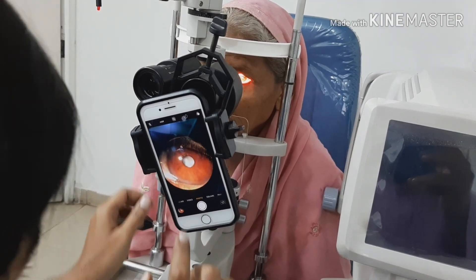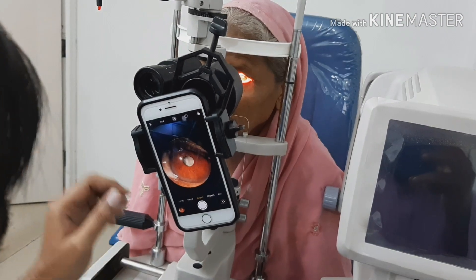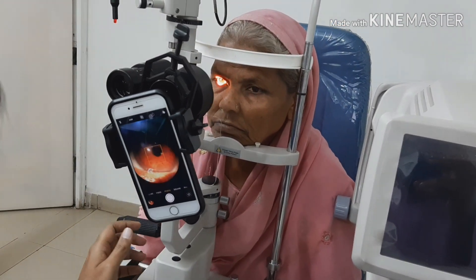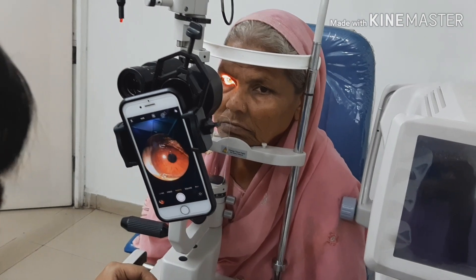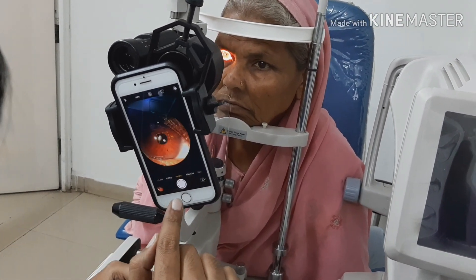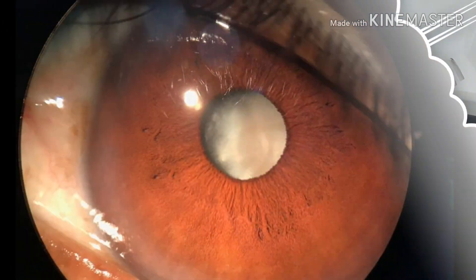You can use the focus on the camera, which gives you really clear pictures. This is very helpful for all residents and fellows for their presentations. I hope this video was helpful. I've included some photos I took with this adapter. Thank you very much.